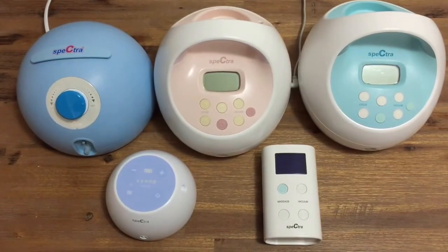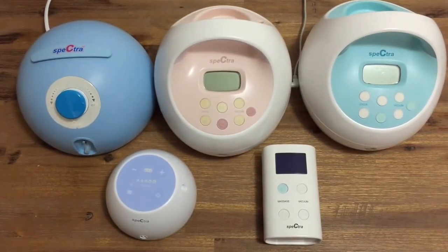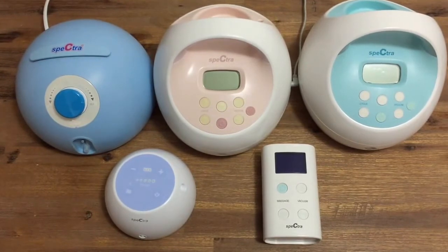All Spectra breast pumps are closed systems, which means that they are able to be used by multiple people safely and hygienically.